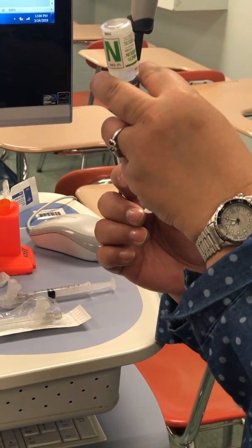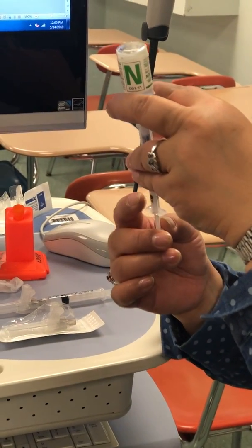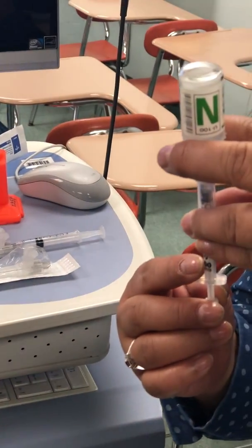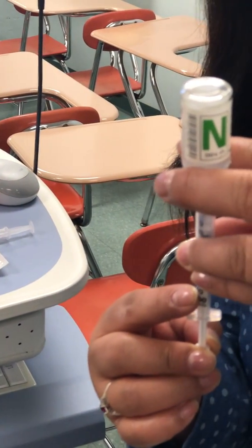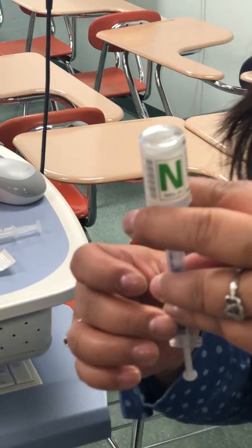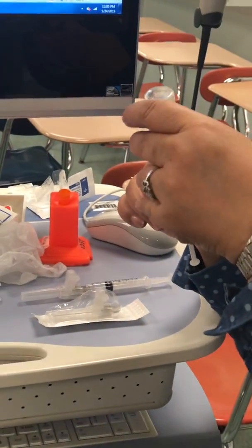It's very fragile, it might bend. So we will go straight to 25, all right? It has to be precise. You cannot pass 25 because you cannot push it back, all right? So make sure it's precise.